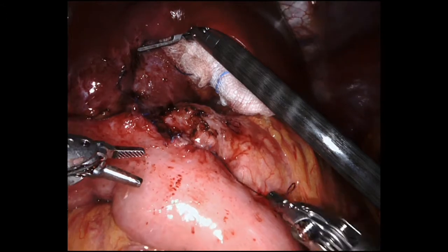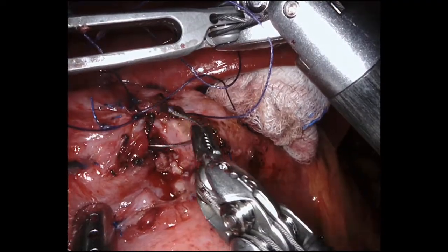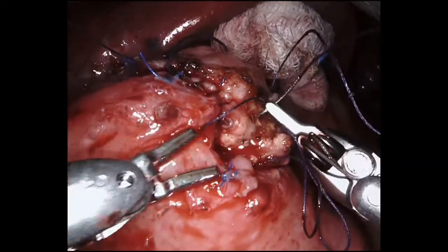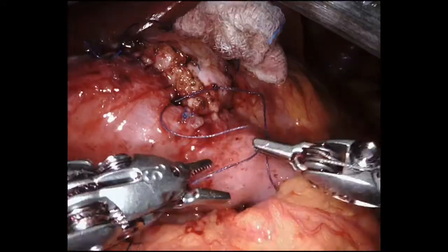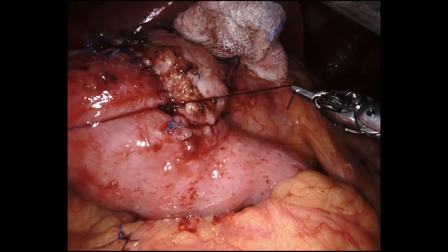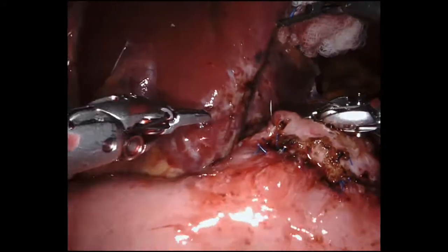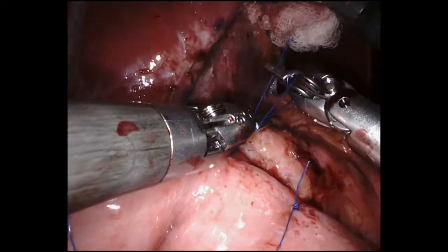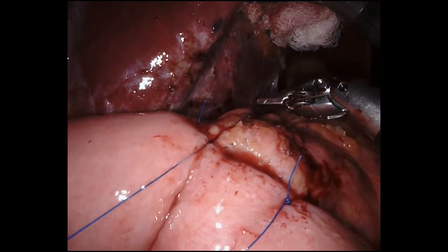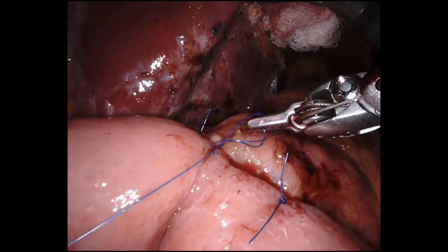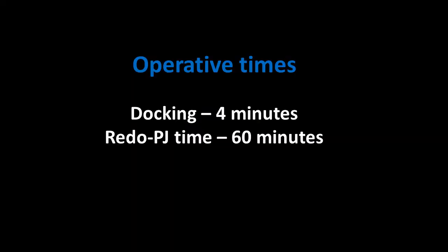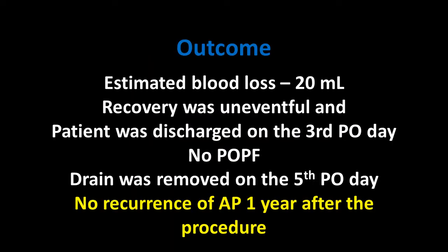The posterior line of suture is completed. The anterior line of suture is performed. The duct-to-mucosa anastomosis is completed. The final step is to perform the anterior layer using interrupted 4-0 Prolene stitches. The anterior line of suture is finished.